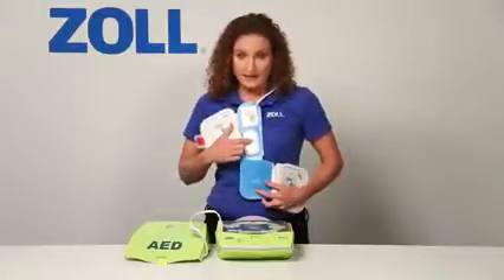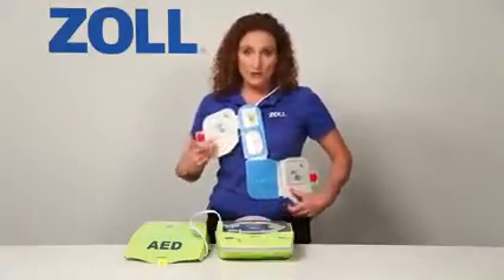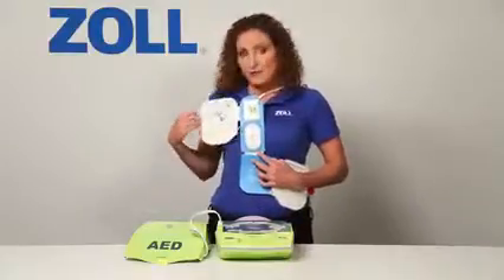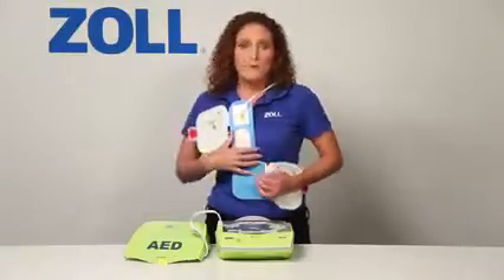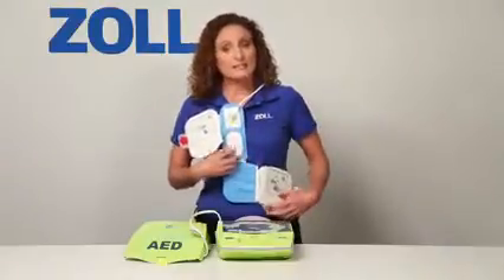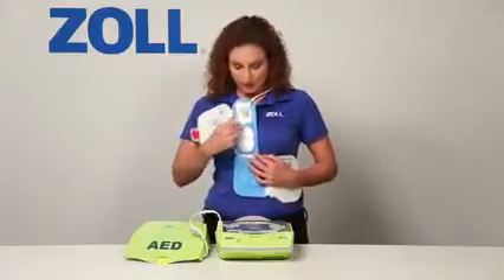The red crosshair is a placement landmark. Put it in the middle of the chest, directly between the victim's nipples, and the two electrode pads will fall into place naturally. Pull on this tab to uncover the gel on the pad and allow it to make solid contact with the victim's skin. Pull on this tab to attach the other electrode pad. Once the pads are attached, CPR can now be done by putting your hands on the red crosshair and doing chest compressions.